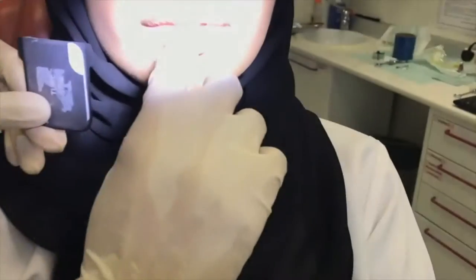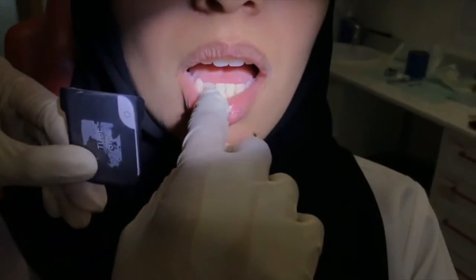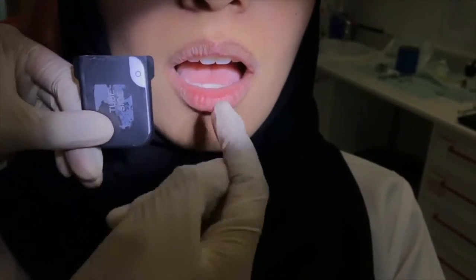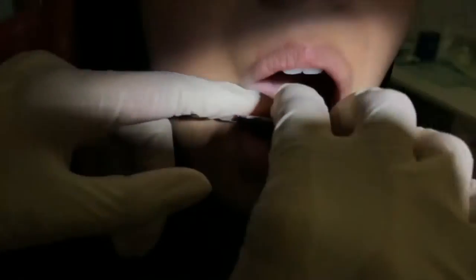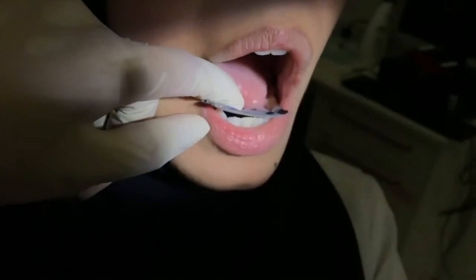Film placement is the same for the maxillary or mandibular teeth. But for the lower teeth, the patient is asked to use the index finger to support and depress the film into the floor of the mouth.